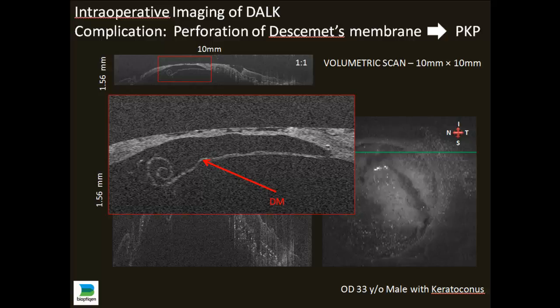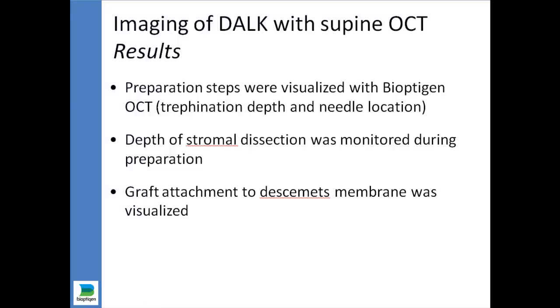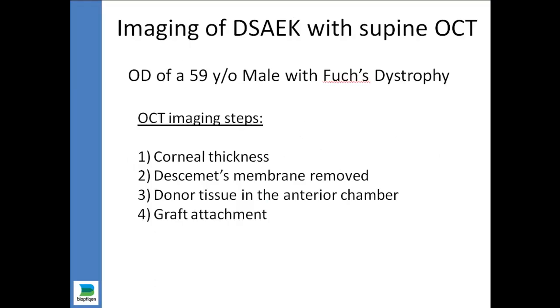Here's a high magnification showing a nice view of the rupture and scroll of Descemet's membrane. The results of OCT imaging of our DALK procedures show that we were able to visualize the preparation steps — the trepanation depth and needle location — monitor the depth of stromal dissection, and visualize graft attachment to Descemet's membrane. Regarding DSAEK surgery, one of the most common complications we see is graft detachment postoperatively, so how can we make this procedure better and minimize that complication?